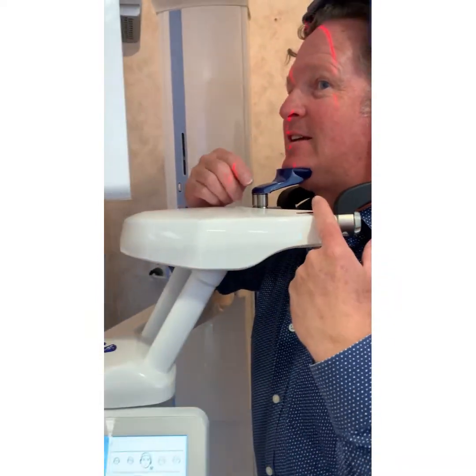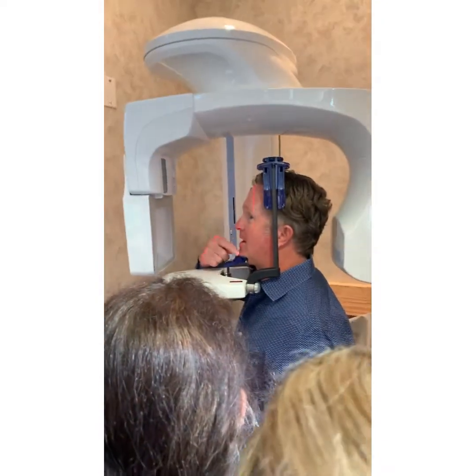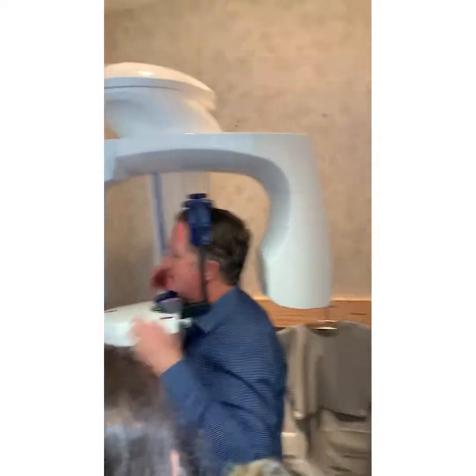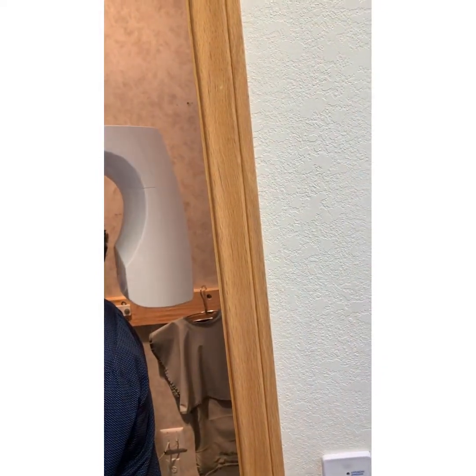Because if you leave this on 10 and 11, this is the front of your soup can. So if you leave it on 10 and 11, you get a big hole here where your anatomy is supposed to be, because it moves the whole volume back. You gotta hit the 90 again because I can't get my big noggin out of here. You're stuck.